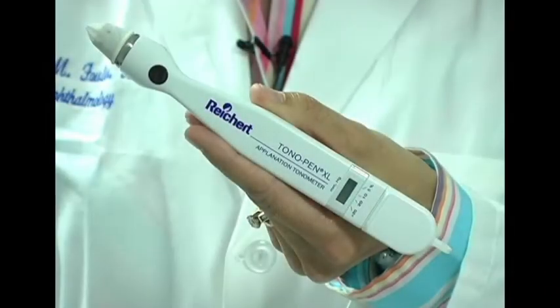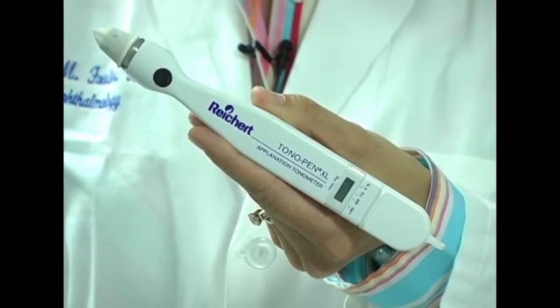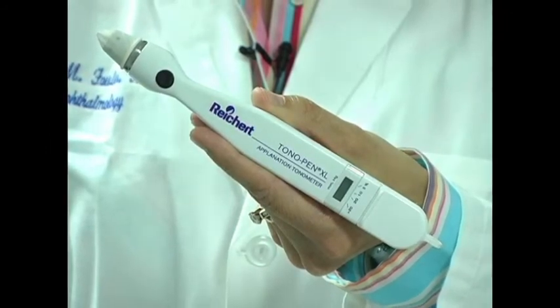The Tonopen applanation tonometer is a pen-shaped device used for measuring intraocular pressures by directly touching an anesthetized cornea. Measurement of intraocular pressures is indicated in the assessment of acute eye injury, acute eye pain, a red eye, and an acute loss of visual acuity. Normal intraocular pressures tend to run between 10 to 21 millimeters of mercury.